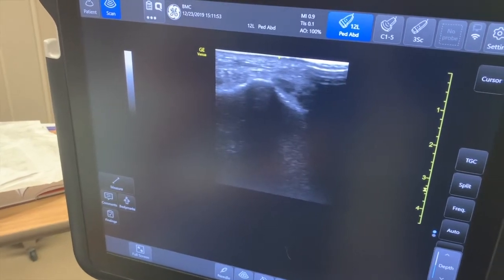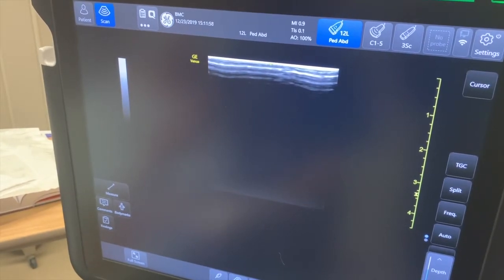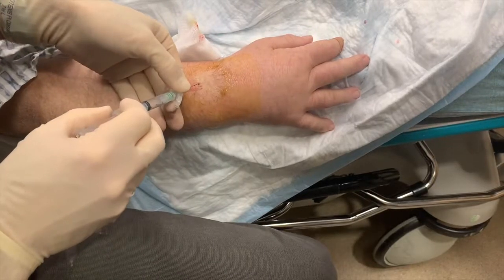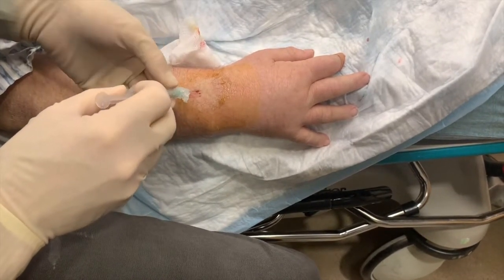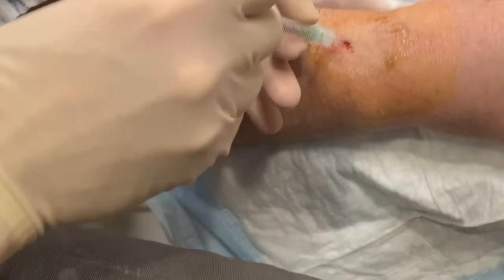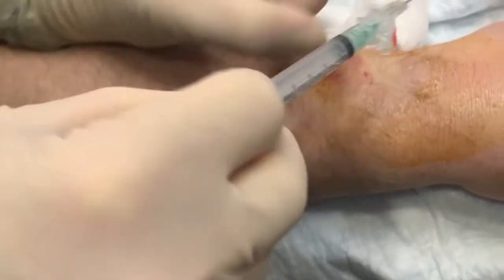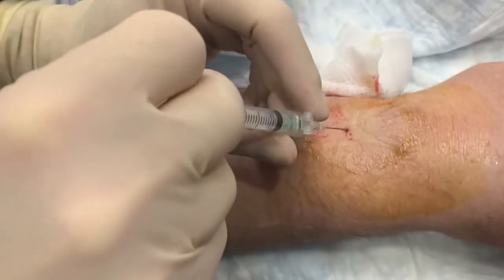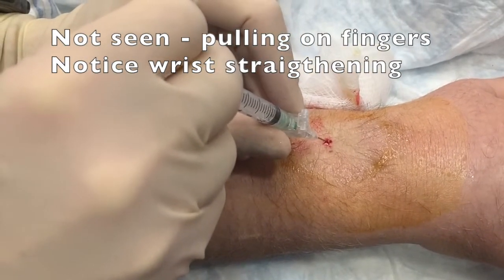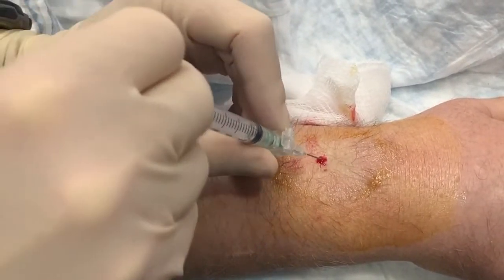How long is that needle? Do you think we get somebody to put some traction on it? Let me just see what I can do to help you — let me take that finger too. Pull out. Sorry, I know I'm pulling on your fingers here. It's okay.